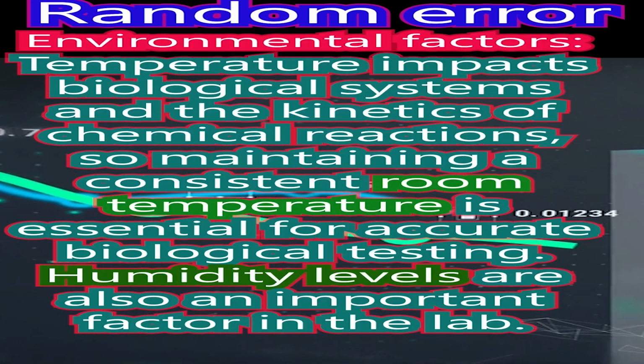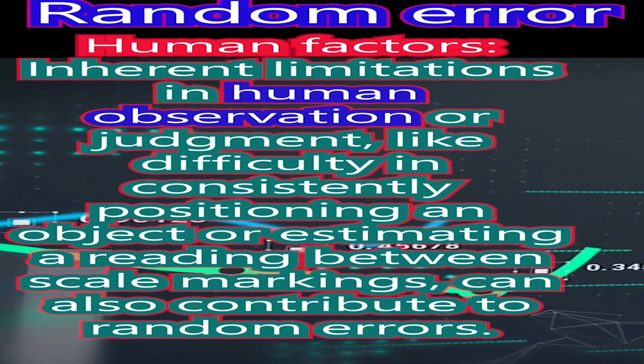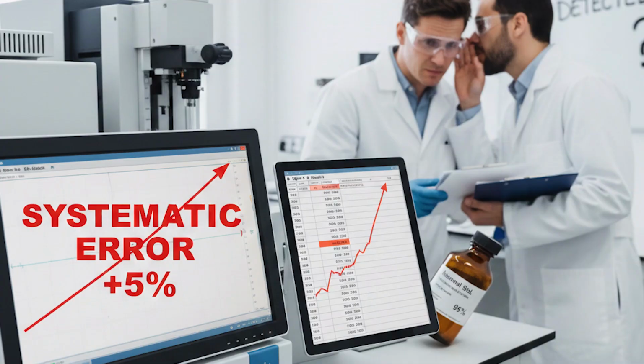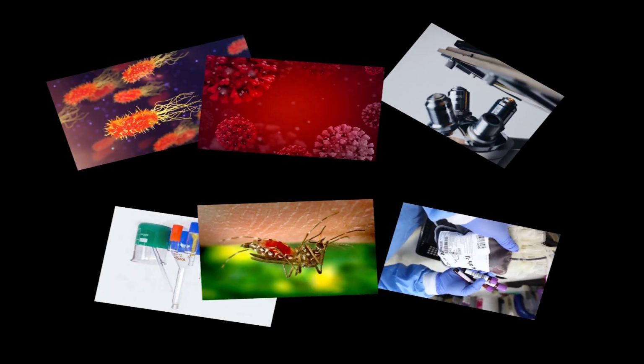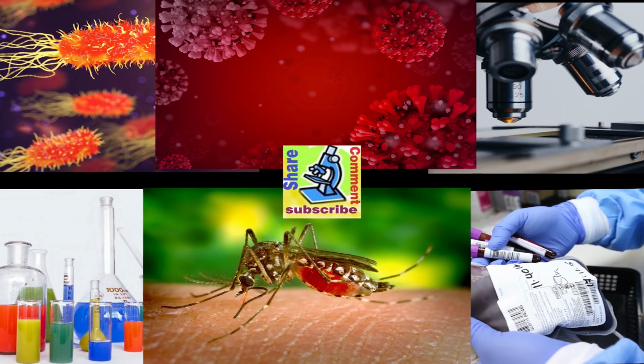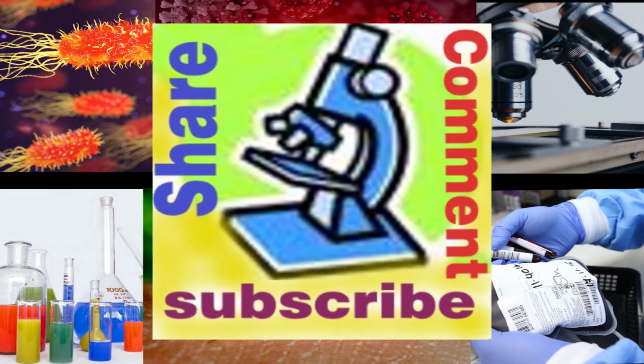The technologist reporting the results must check the instrument condition periodically. By looking at the results, bias in any instrument or any test should be noted and the results should not be reported. The technologist has the responsibility to detect the pre-analytical and analytical errors before reporting the test reports. Reporting of each erroneous result will affect the hospital and the lab reputation.